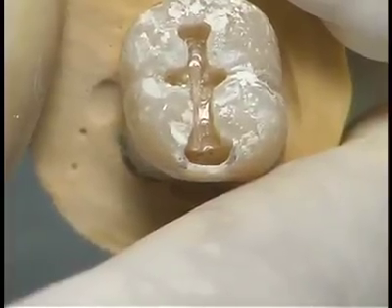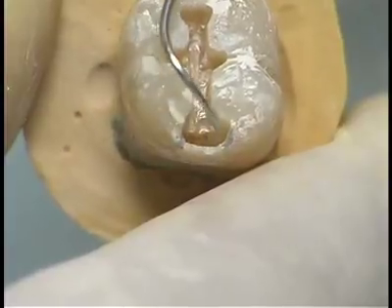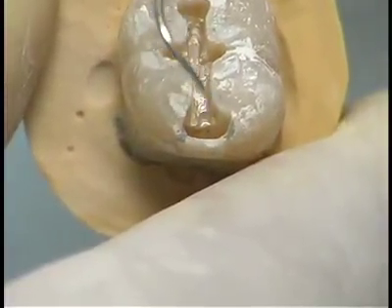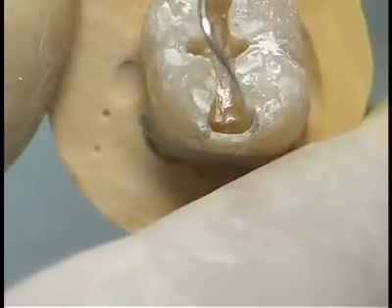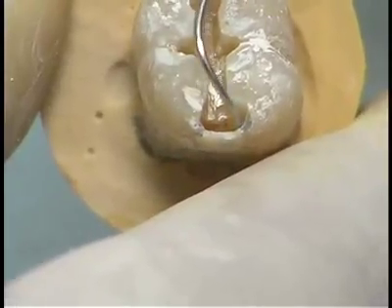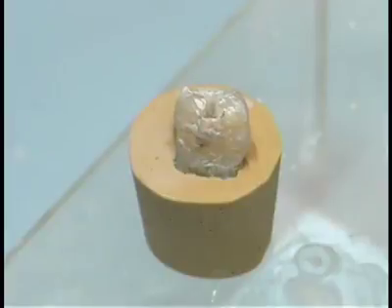The gingival margin should be extended gingivally to clear the adjacent tooth by 0.5 mm and to remove the entire carious lesion. A slot has been prepared, which is partly in enamel and partly in dentin. The slot is diverging gingivally to ensure that the facial-lingual dimension at the gingival is greater than at the occlusal.